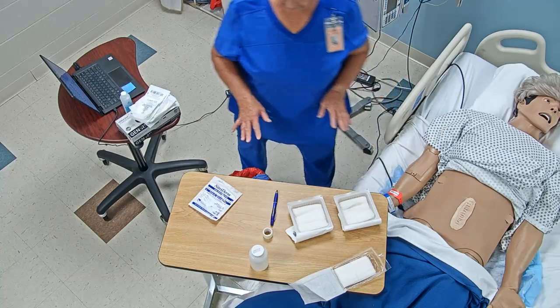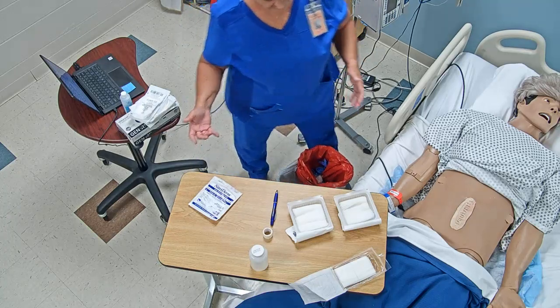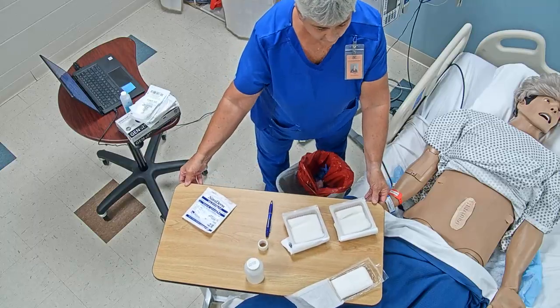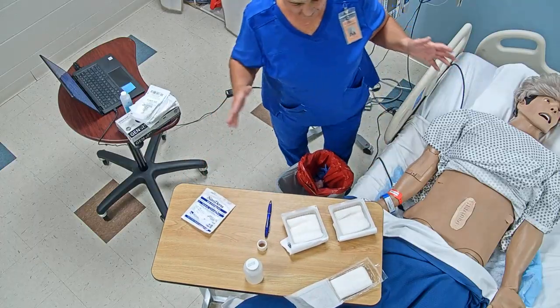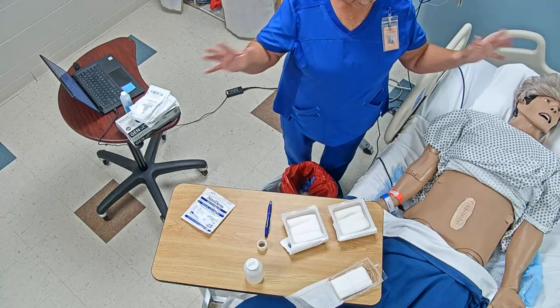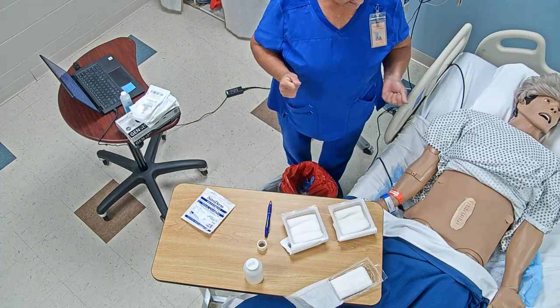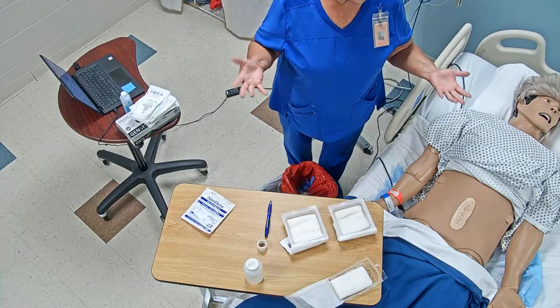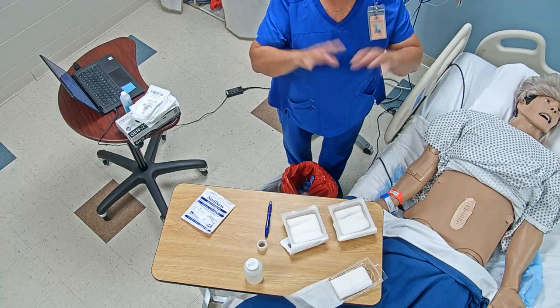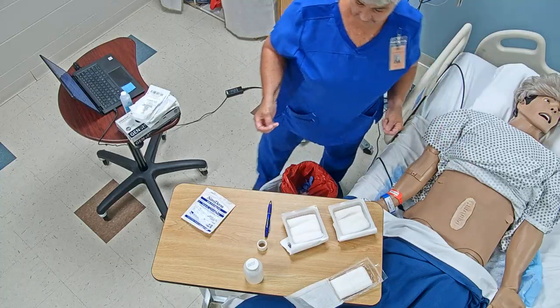Okay, so we've got everything done there, and as you see, I've got my table turned because we want to be able to keep our sterile field in our view at all times. I kind of think of it as a wide angle camera right here. I've got my biohazardous bag right here because once I put my sterile gloves on, my hands have to stay in my box, okay, as I'm doing that, okay?